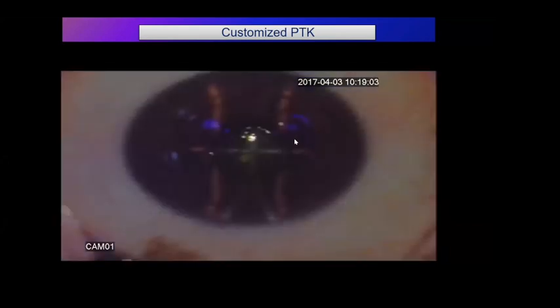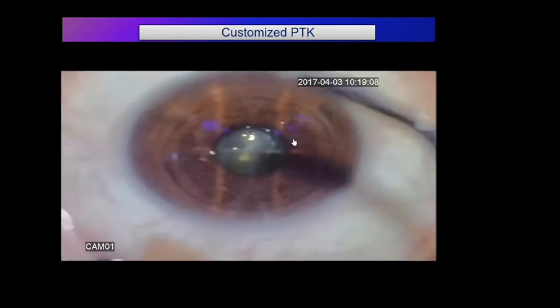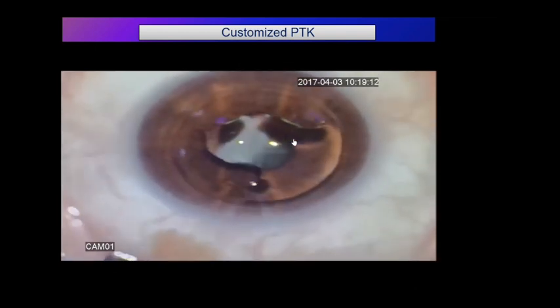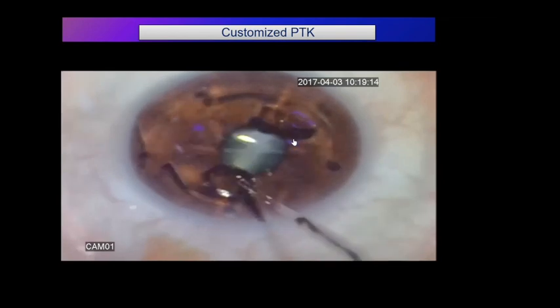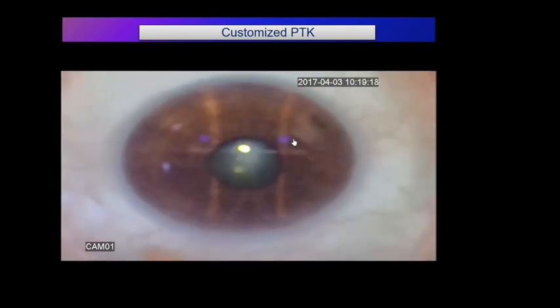And then here we put the fluid. Look at the surface. We put the thick one. This is thick, you see that? And then we try to add some. We make it more or less regular, and then we reapply. So it is a technique. You put and treat until you look at it. The one which was with lines and lines, now they are disappearing. You see that. It is much better than before.